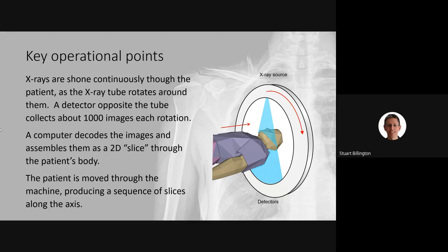And when that's mapped onto an X-ray, you have the part of the chest that's down by the stomach, and the part of the chest that's up by the throat, and the part that's by the left arm, and the part that's by the right arm. It's not that two-dimensional image that's going to be produced. Instead, it's a little bit more like you've sliced the patient open from the front of their chest to their spine, and you've taken the head and shoulders off, and you're looking down on a slice across the patient. So a very, very different two-dimensional image that the CT scan produces.